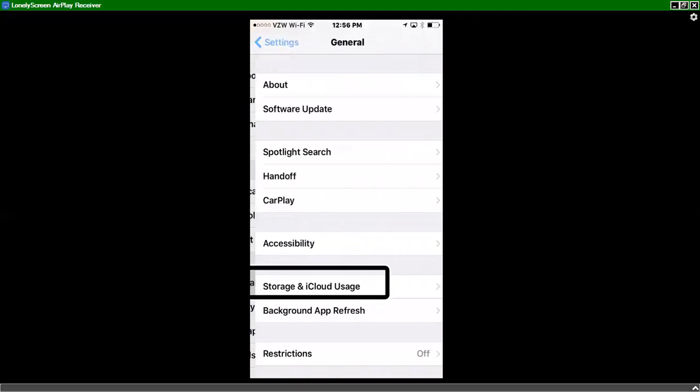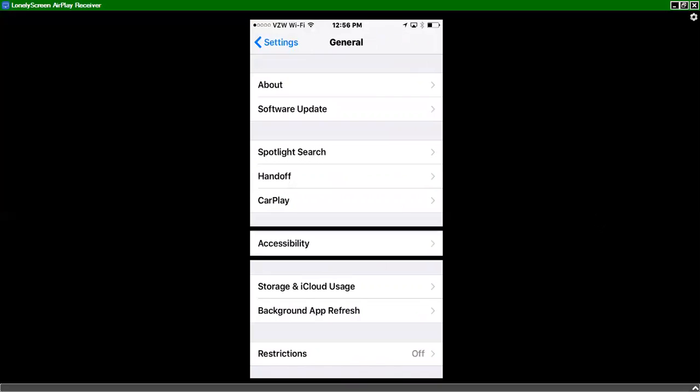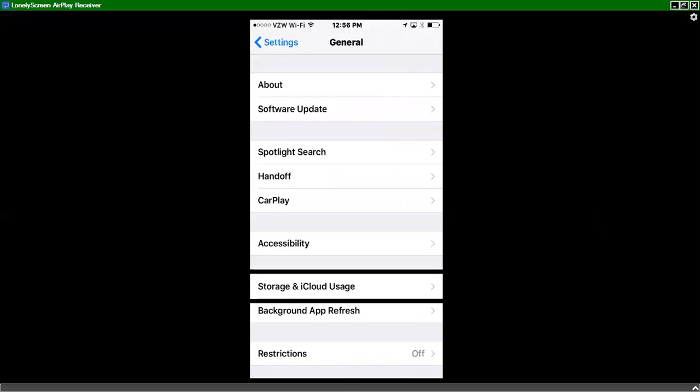Select. General. And we'll go to accessibility. So I'll swipe right. Handoff. Contacts. Accessibility. Accessibility. There it is. I'll double tap.